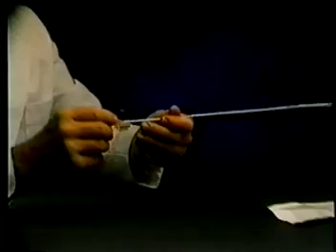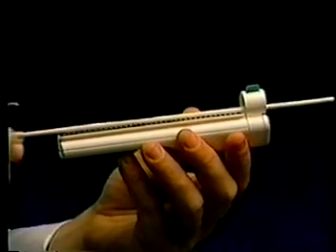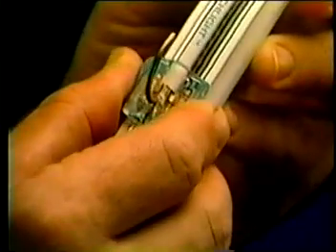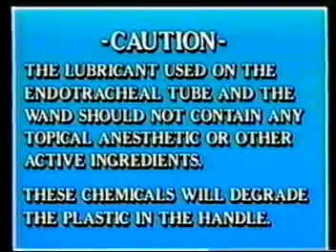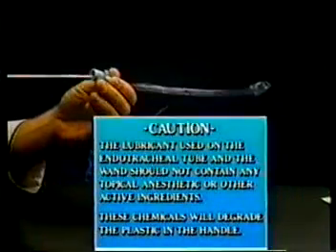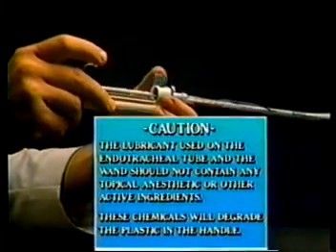Remove the wand from its package. Orient the stylet and press it firmly into the slot. Pass the tip of the wand through the clamp and, while squeezing the connector release arm, carefully slide the connector onto the handle. Lubricate with a water-soluble lubricant. Insert the wand, push the fitting firmly into the clamp, and flip the locking lever.